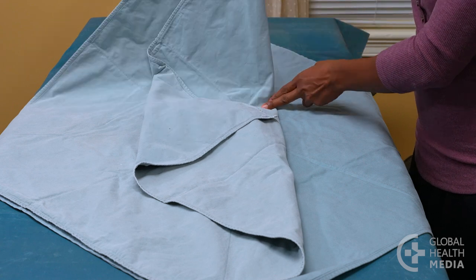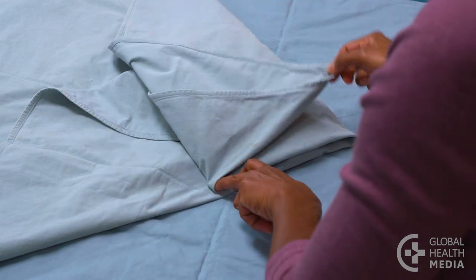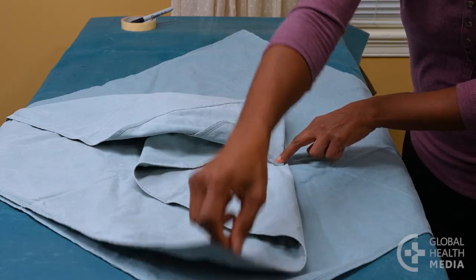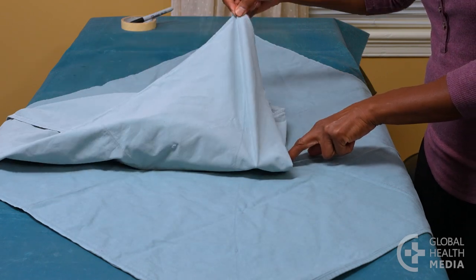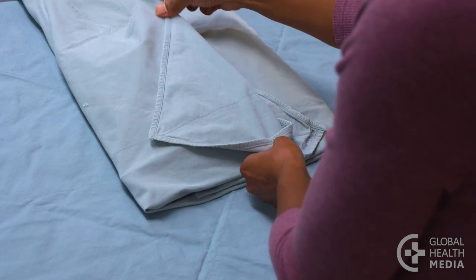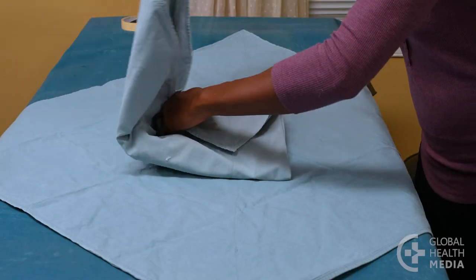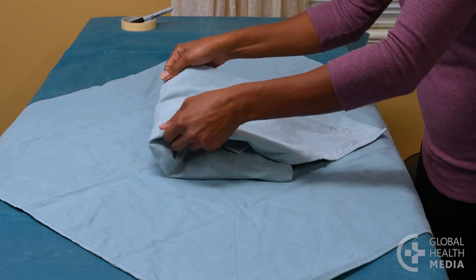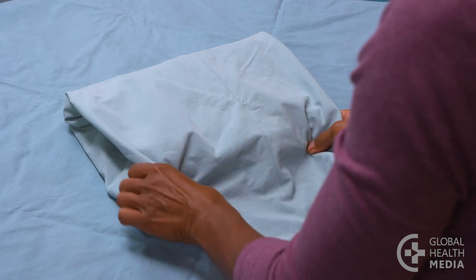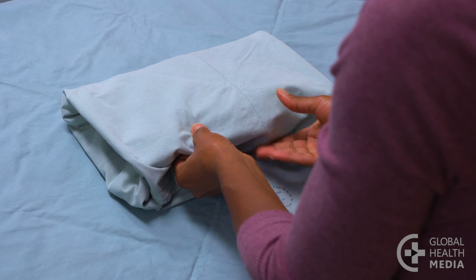Fold the right corner over the contents, then fold the tip back. Then fold the left corner over the right fold and fold the tip back. Bring the top corner down over the contents and tuck the corner under the right and left folds, leaving a small tab visible for easy opening.